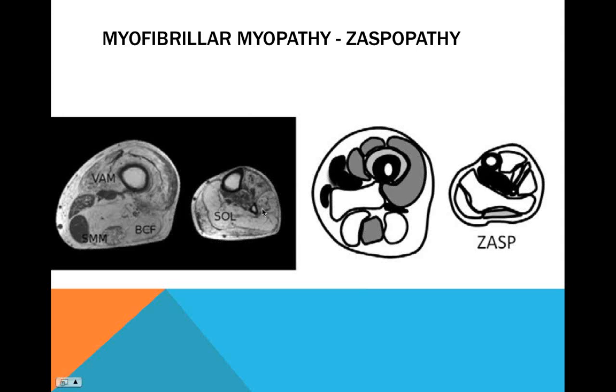But actually, we are sharing this data with the University of Florida, where they're doing all of the data analysis on it. Because we don't need to really describe the phenotype or what it looks like on the MRI, because it's already been fairly well described for these disorders. But what we are having them do is an extra analysis on the muscle tissue, which is with that 3-point Dixon to separate water from fat, and also some spectroscopy to look at the metabolic breakdown.